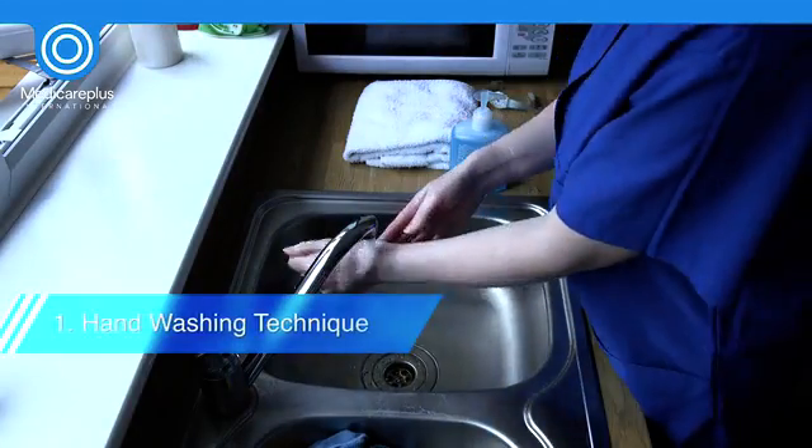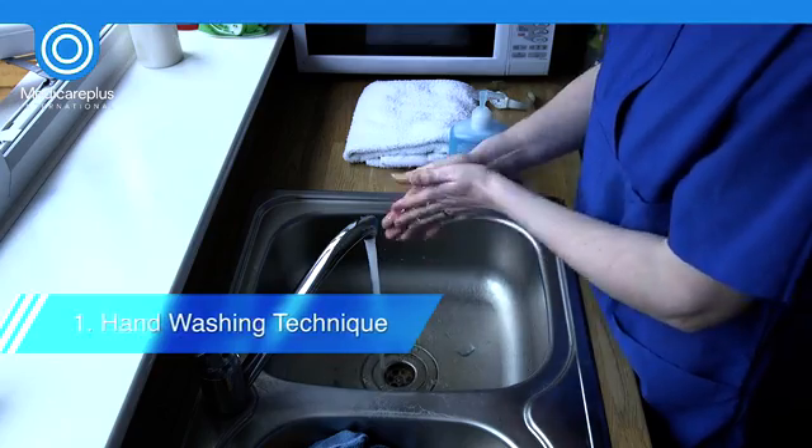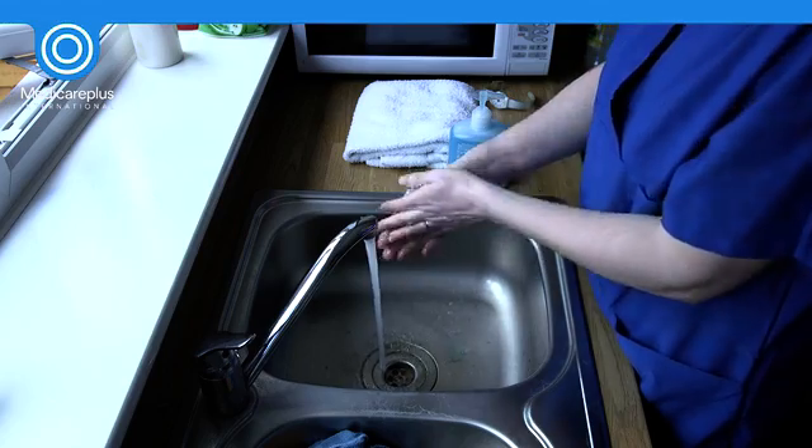To begin, hands should be cleaned thoroughly with liquid soap and water. Hand cleaning wipes and/or alcohol gel can be used if the facilities and environment are not suitable.